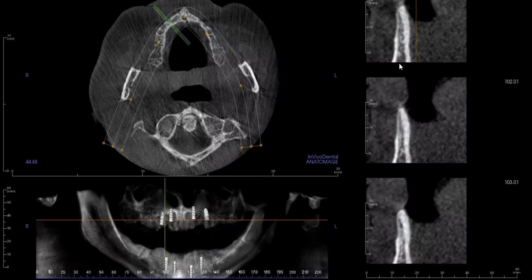It is a treatment modality that has success, but there's a large learning curve with it, and I do think the success rate is much lower than conventional implants. With all this said, BioHorizons has a 3 millimeter implant that has been shown to be very strong over the long term. I do think that we could potentially just use those here. I think that would be the simplest way to go.